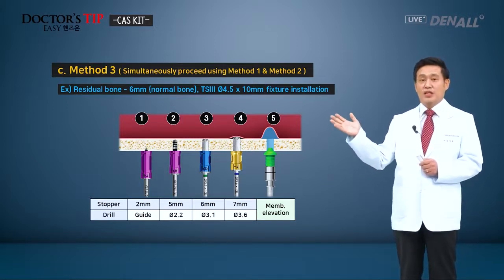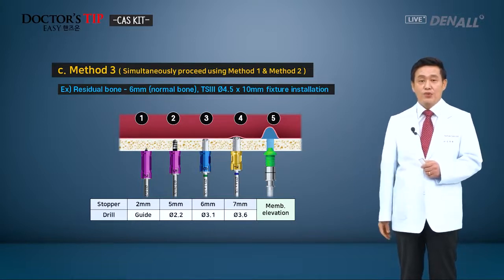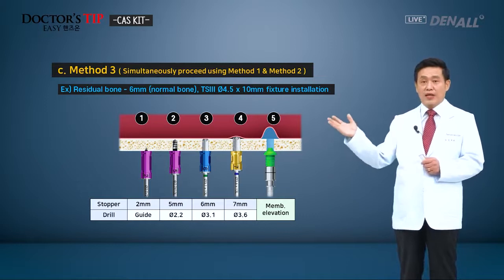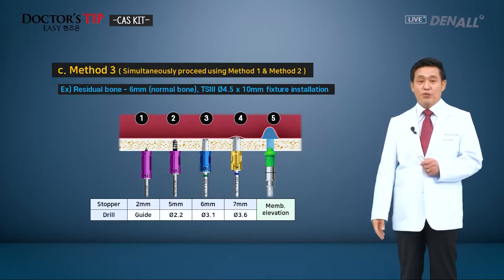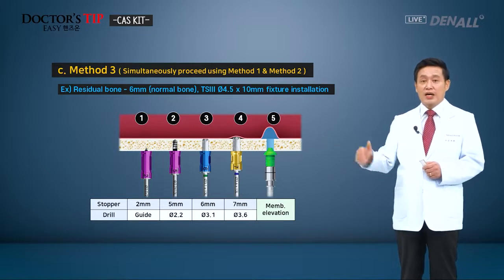Out of method 1, 2, and 3, you can choose whatever fits you, whatever is convenient for you. If you get used to using CAS drills, you'd prefer to use method 3 because it has the simplified sequence.